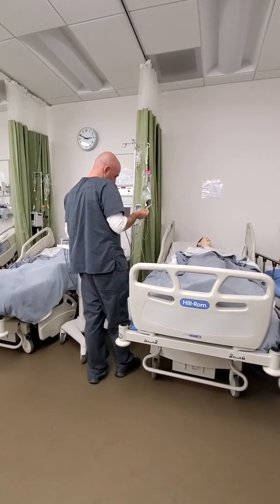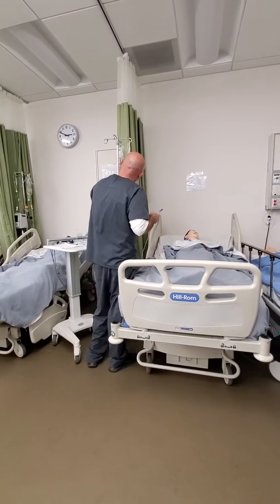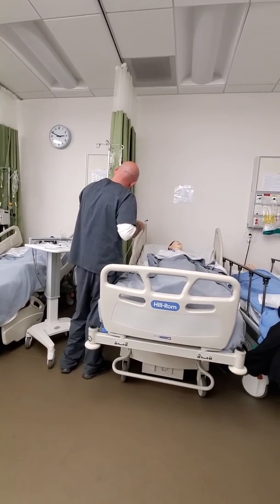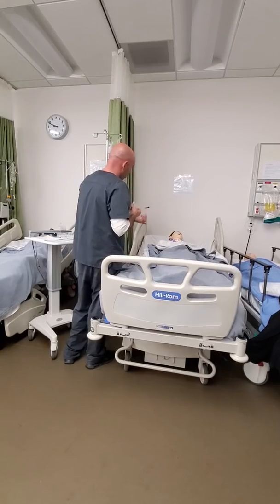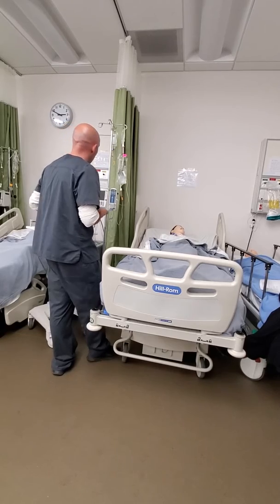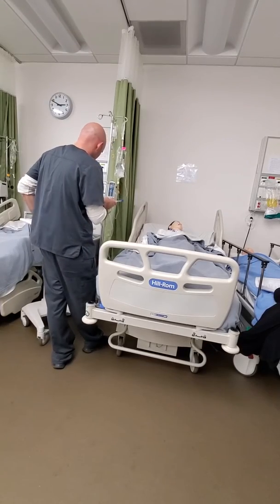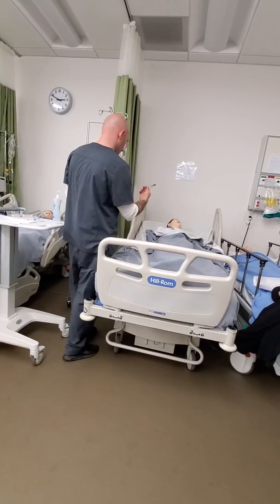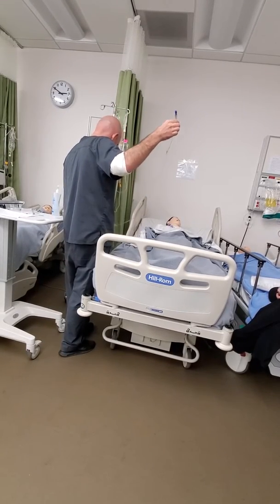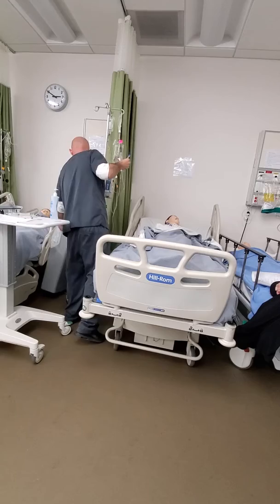Connect. I wanna make sure that this whole line is, yeah, I'm drawing a blank now. I wanna connect this to the port that I already flushed, but I wanna ensure that there's no air in here. This is clamped, so then I can open this and drain this into a waste bucket to make sure that there's no air. Well, you can look at it visually to see if there's air, right? There is air, right there. There's no air, oh, and there's air up through here. Yeah. And this is open, so I have to do that.